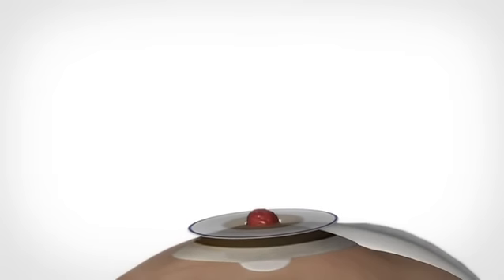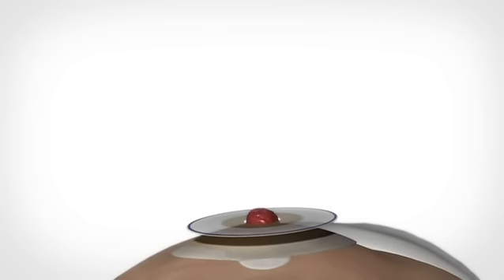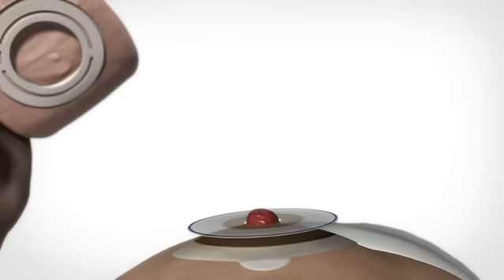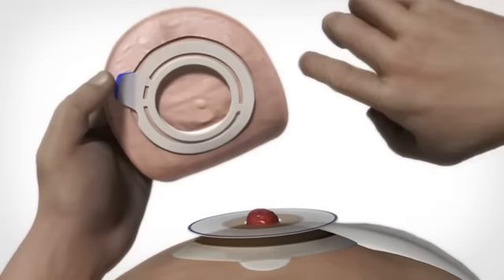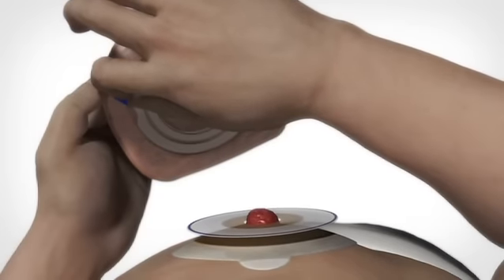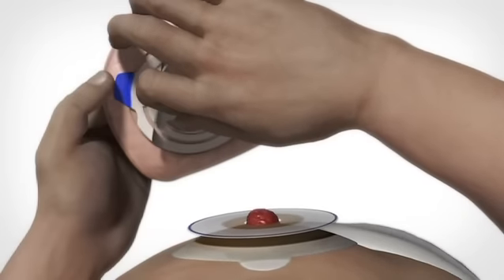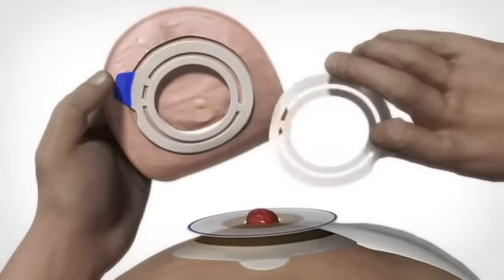Before attaching the bag to the base on the base plate, you must ensure that the base is dry and clean. When cleaning the base, use only water. Now remove the protective paper from the adhesive ring of the bag. Avoid pulling or stretching the adhesive part on the bag.